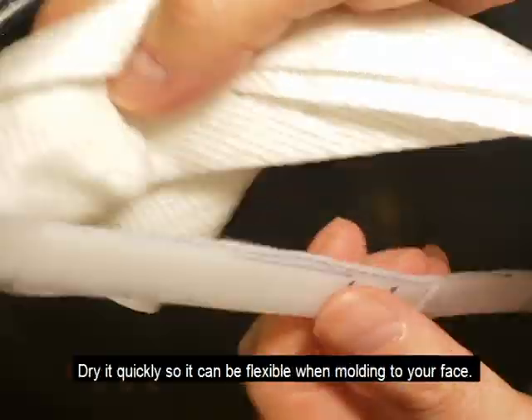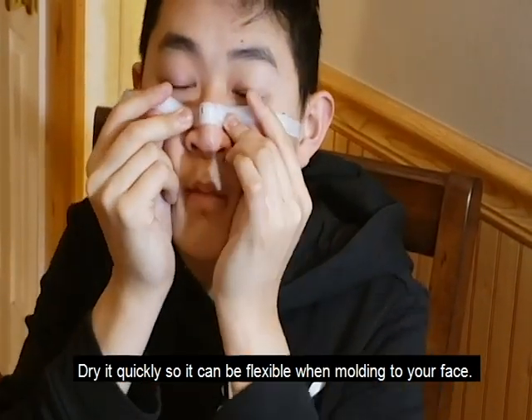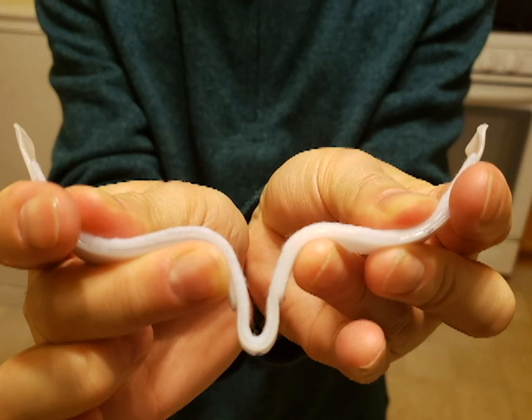After determining that it is clear, dry the plastic with the felt and then put it onto your face to mold the plastic. Press the assembly on the bridge of your nose and wrap it around the nose. Adjust the plastic strip following the curve of your face, using your fingers as shown in the image.